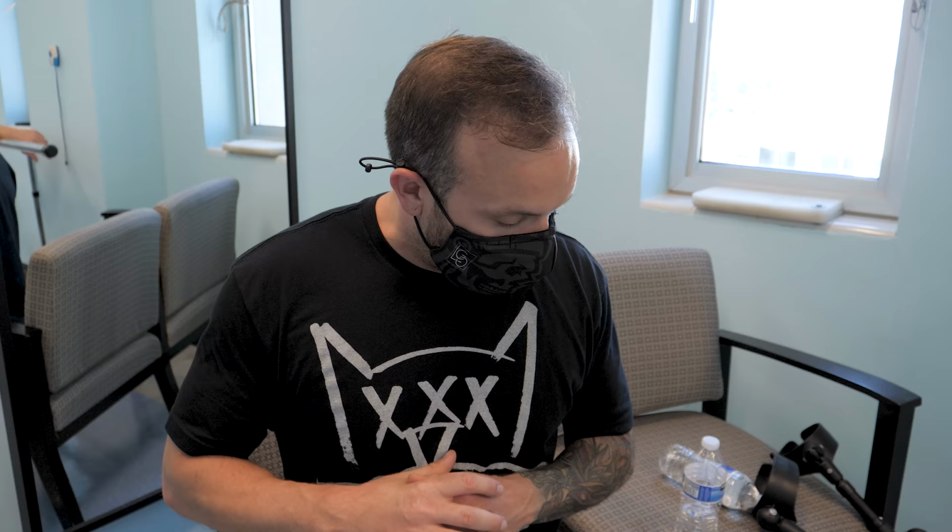I'm excited about it. I think it's really going to do what I think it's going to do. The trial version is twice as heavy and definitely clunky and kind of makes my toe roll out a little bit, but I don't really know how to describe the way it feels other than it feels like a big stretchy rubber band or maybe an extra tendon in my leg that I never really knew was there. And the way that you deploy it is almost intentionally falling. If I buckle my knee, I fall, but in this case, I have to buckle my knee in order for the brace to actually activate. That is a really strange pattern that I'm going to have to get used to, but all in all, from the trial perspective, I'm thrilled at the possibilities of what this is going to look like and what the next stages are.